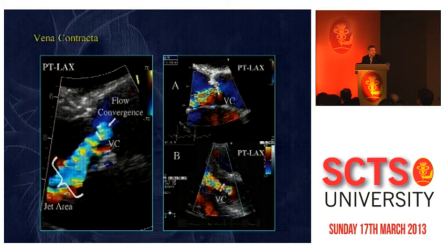This is because all the red blood cells at that very level have the same velocity. And what velocity? The one that is shown by the machine, and I cannot read, but probably something like 30 or 40 centimeters per second. Now you know the velocity of the red blood cells at that level, and you know the hole is located here, so now you have the distance between this shell and the hole. That is the radius of a hemisphere. And at that level, every red blood cell has this 30 centimeters per second velocity.